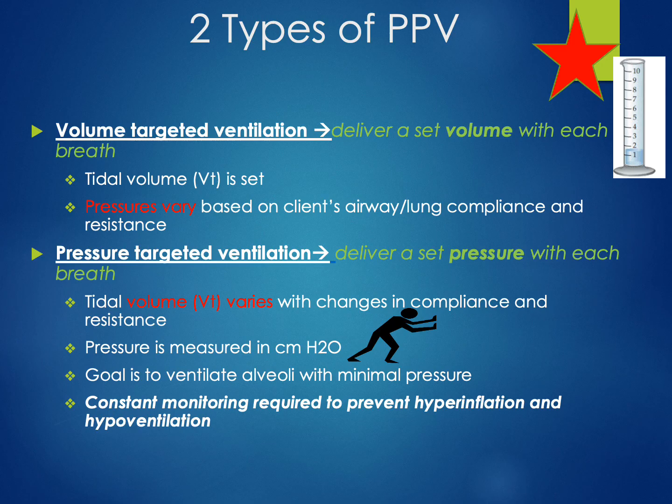And then what if someone else said, okay, now get the whole bucket full with one pump. And then let's say again you're working with an old, rusty water pump. You may have to push as hard as you can. You may even have to ask for help from somebody else to push as hard as they can to hit that volume goal. So you might already be thinking about how this would translate into a ventilator.